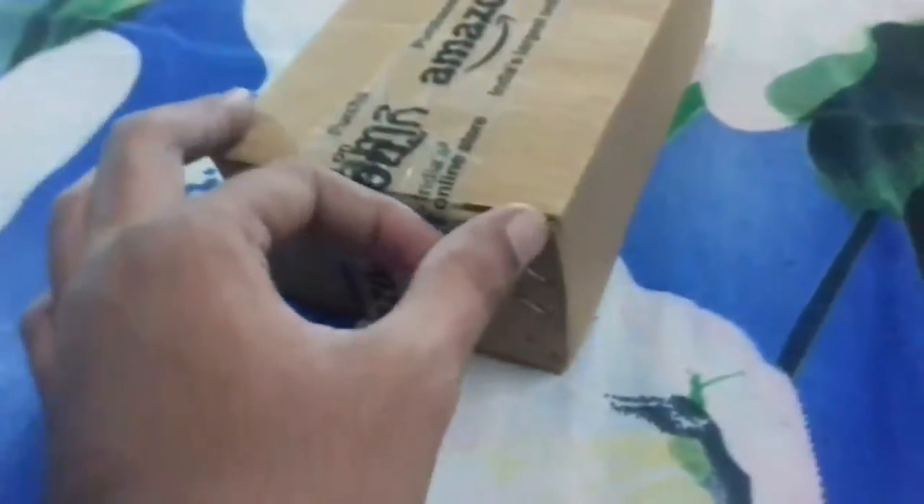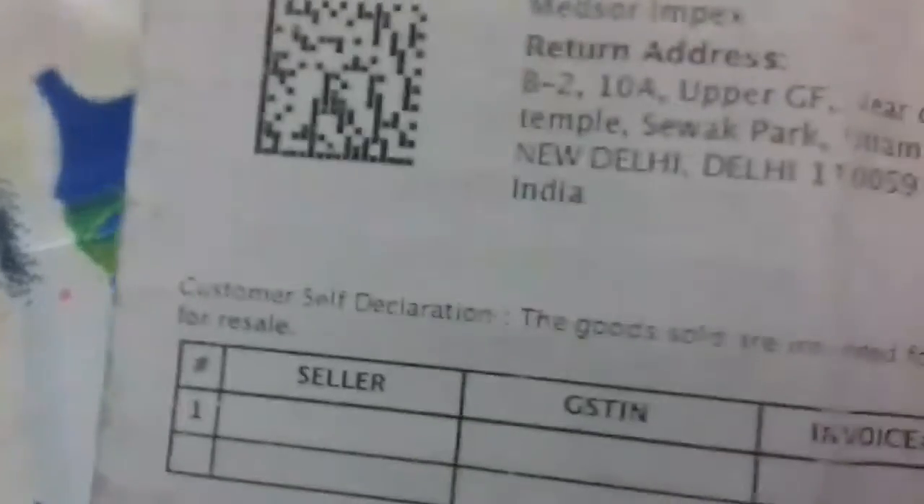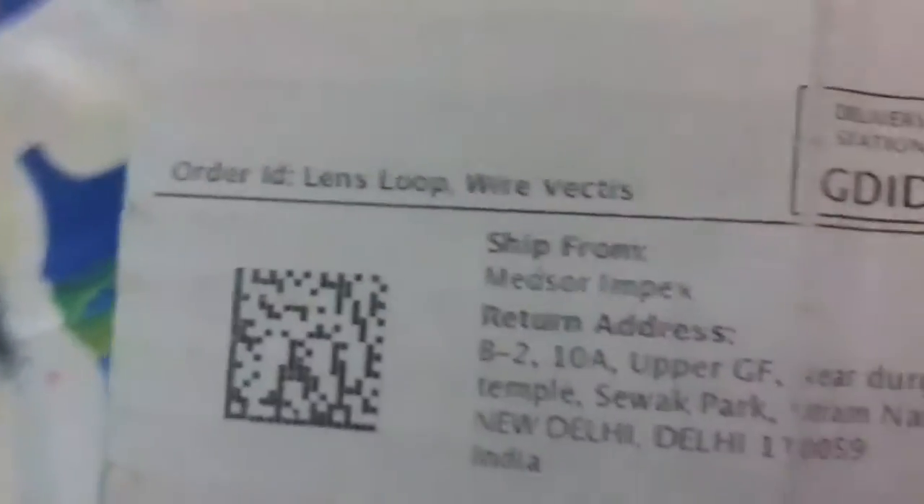Hello friends, good morning. Today I'm going to show you one more thing I ordered from Amazon. You can see the box packing. This is the bill — the price is 325 rupees. It is an instrument called a lens loop wire vectis, and the price is 325 rupees. Let me open the box first.